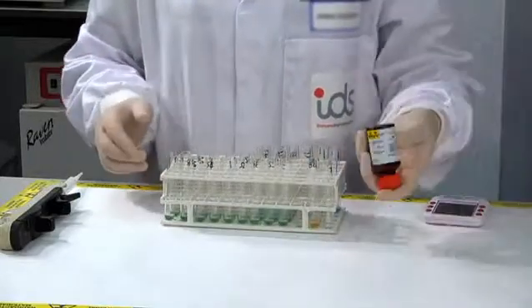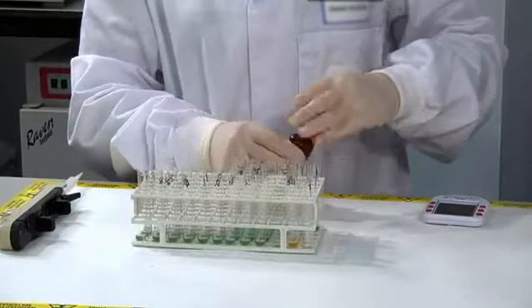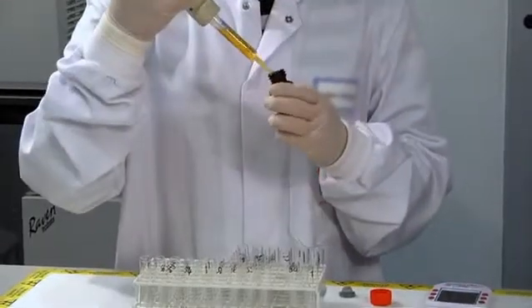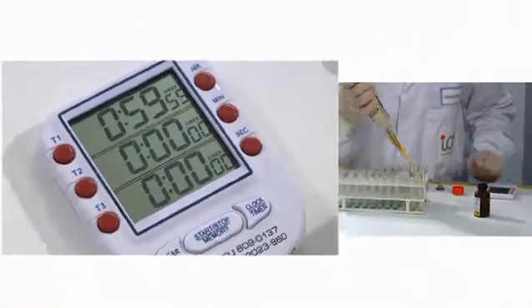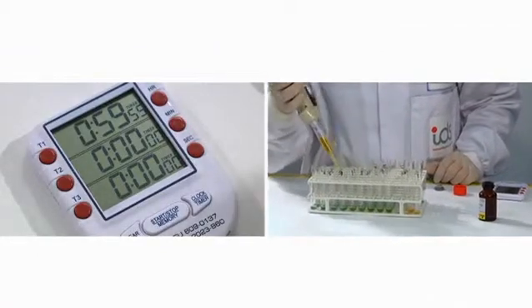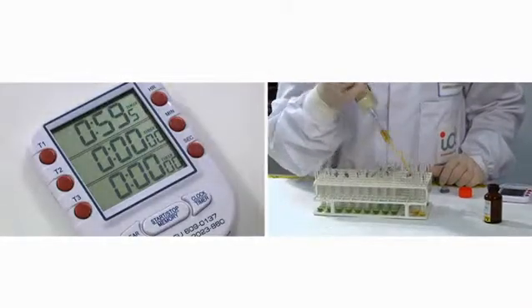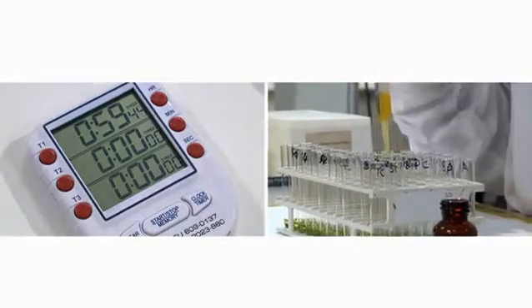Remove tubes from fridge. Immediately add 200 microliters of room temperature tracer to all the tubes. Remember to start timer on addition of tracer to the first tube. This will ensure that incubation time is exactly one hour. It's important to start timer immediately upon addition of tracer to the first tube.